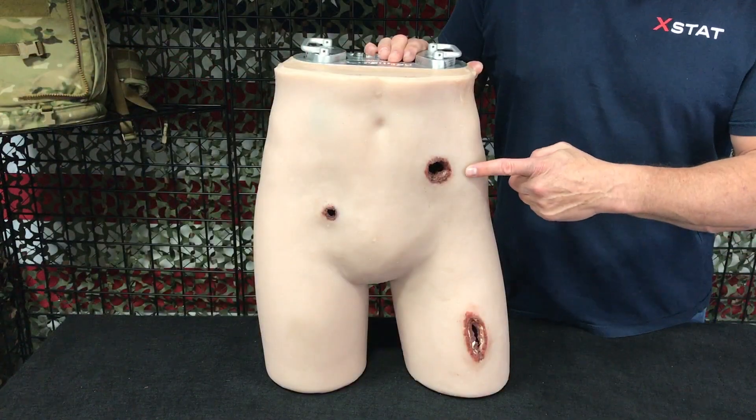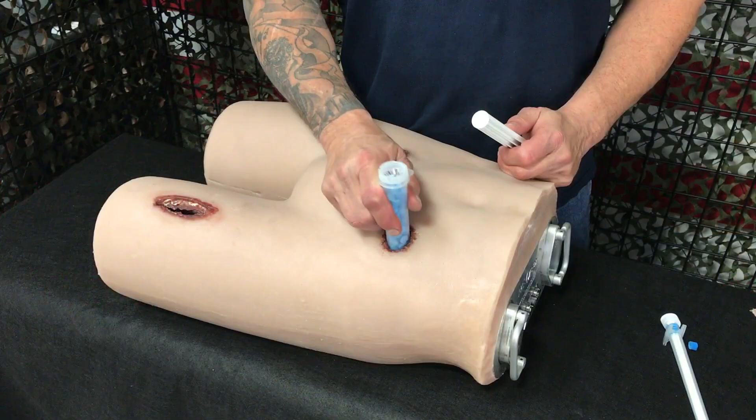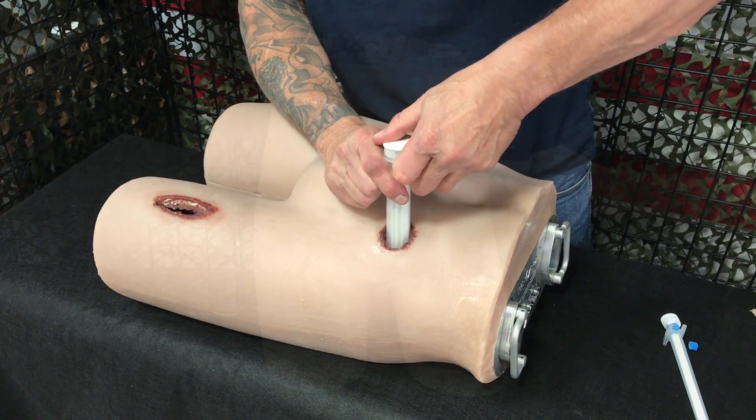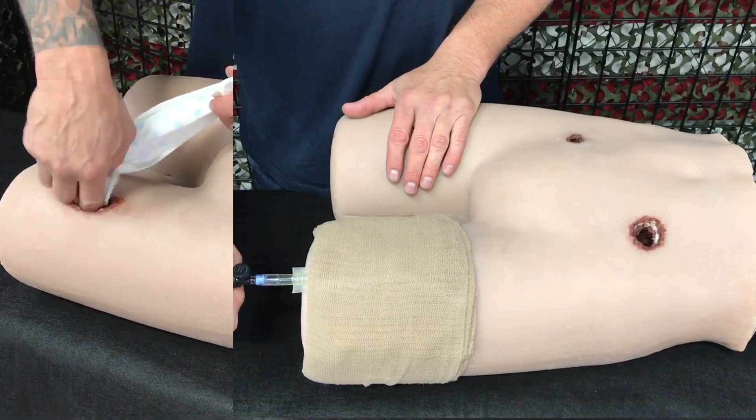A large pelvic exit wound. These types of wounds are typically caused by high velocity projectiles, such as a large caliber rifle, that pass through the body and require extensive packing, and a mid-thigh wound designed for wound packing, applying pressure dressings, and tourniquet application.